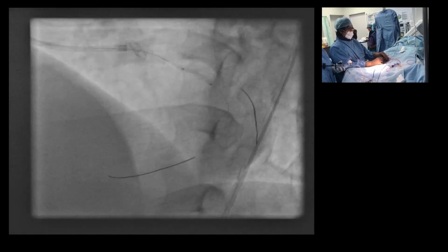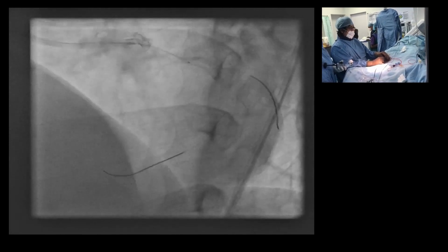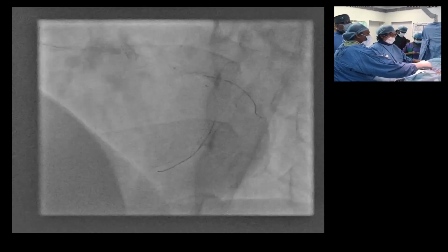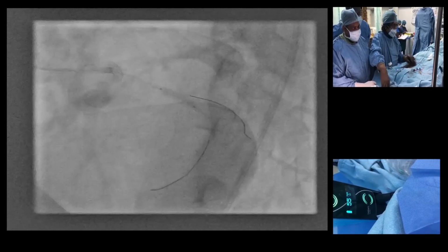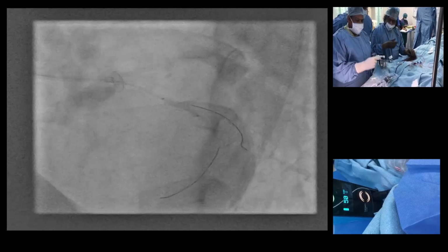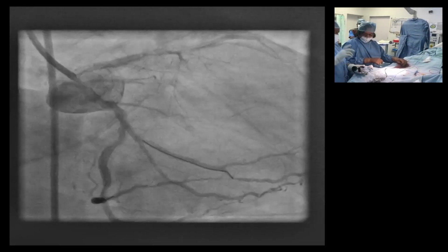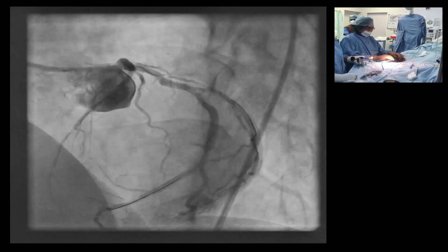So a pre-dilatation with a 2 into 10 balloon has been done because the IVL balloon is a bulky one, difficult to negotiate this lesion with the tortuosity and tightness. Finally, an IVL of 3 into 12 could cross the lesion, and a total of 5 cycles were given at 10 pulses each with 4 atmospheres pressure and kept at 6 atmospheres for a few seconds. But the patient had chest discomfort with ECG changes and a short length of junctional rhythm during the IVL dilatation, which is expected during IVL dilatations.